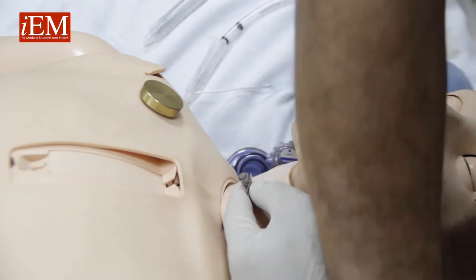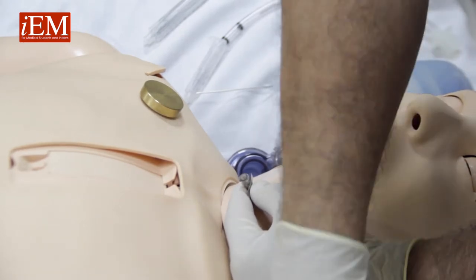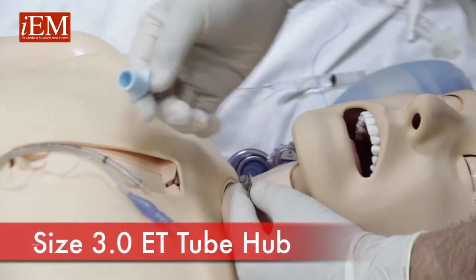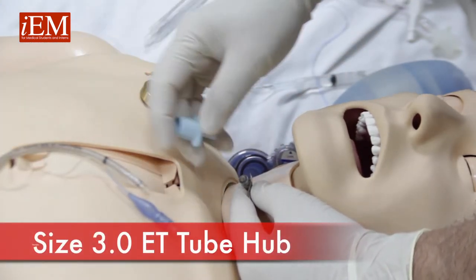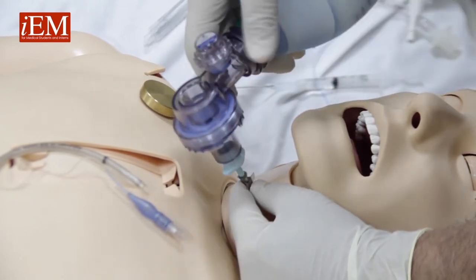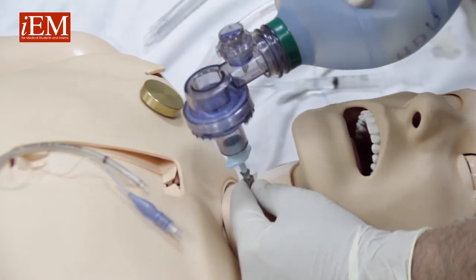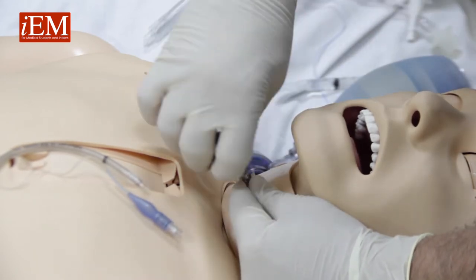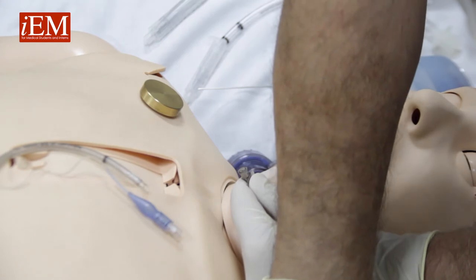Option one: take a size 3 endotracheal tube and connect the hub of the size 3 endotracheal tube straight to the endocath, and we can bag.